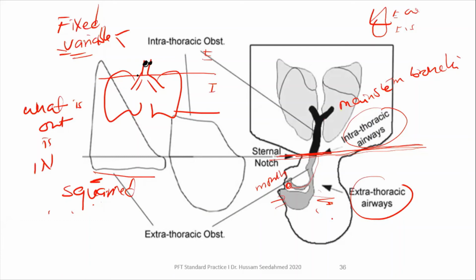Say for example هنا we have a lesion in the upper airway that is extrathoracic, for example vocal cord paralysis or vocal cord constriction. So usually these will affect which phase? Inspiration. How or why do they affect inspiration? طيب during expiration انا هتكلم ب two pressures. هنا انا الان بتكلم عن extrathoracic. طيب هنا عندي the tracheal pressure وعندي the atmospheric pressure.